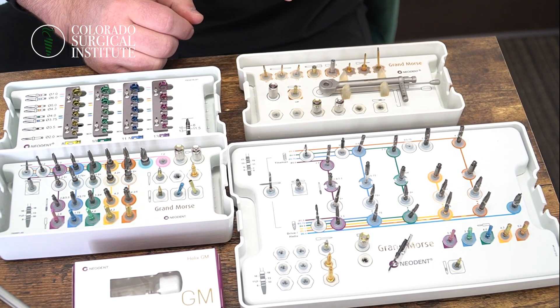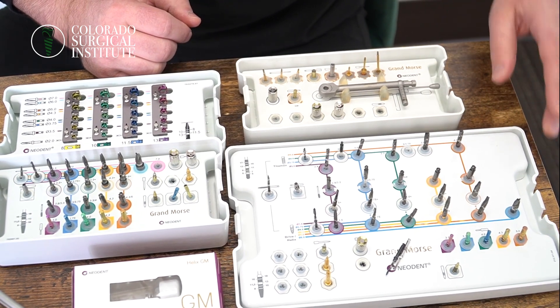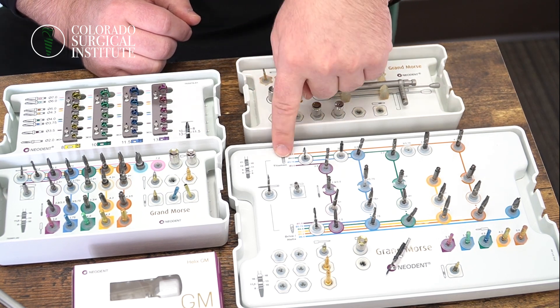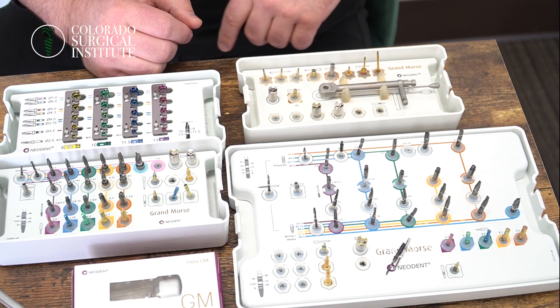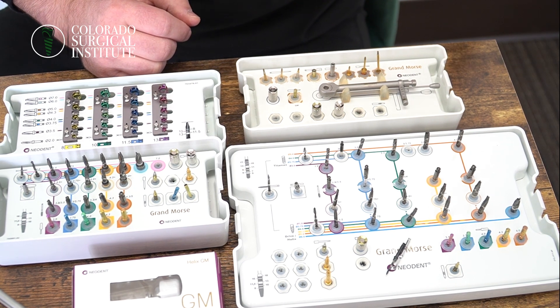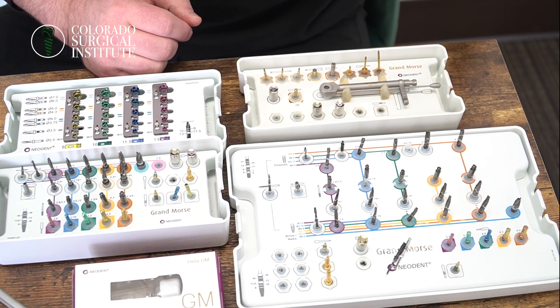Let's say you are impinging upon a nerve area in the posterior and you really need a little bit shorter implant. Titamax actually has a seven millimeter implant, which is fantastic. And within the next year or very soon, they're actually going to be coming out with a six millimeter implant — some pretty cool stuff to come.